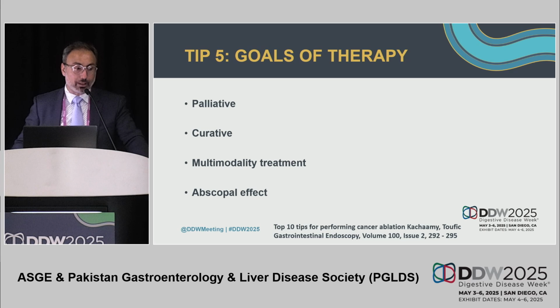One thing that we are increasingly trying to go after, which has been the holy grail for endoscopic ablation, is the abscopal effect, which is a systemic response to a local therapy. More recently, we have modalities that are starting to be effective in that, and that's something I think you should keep an eye on.